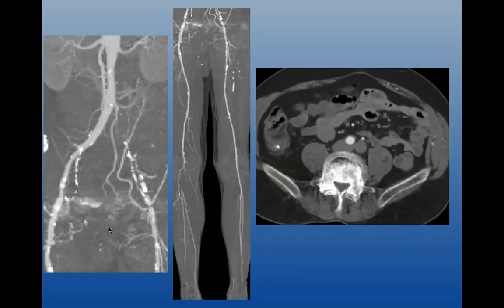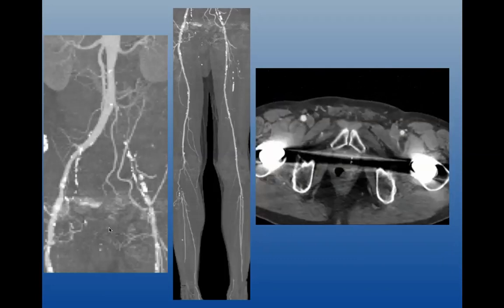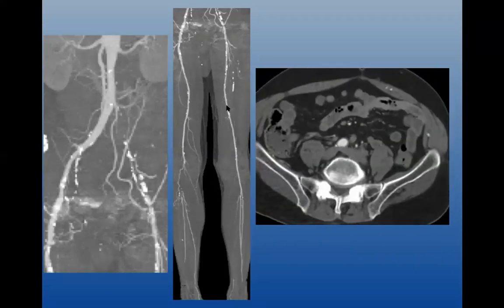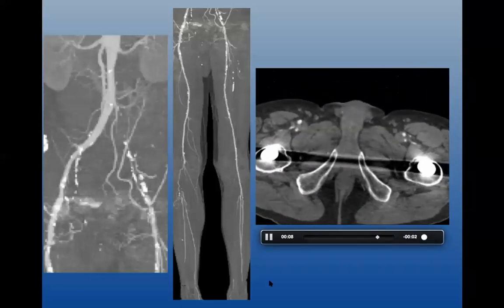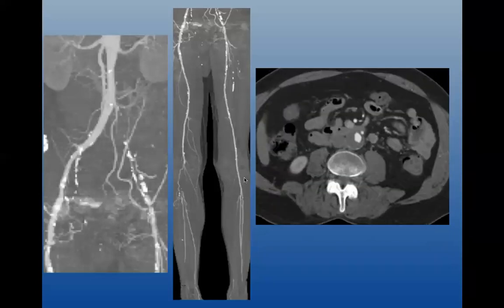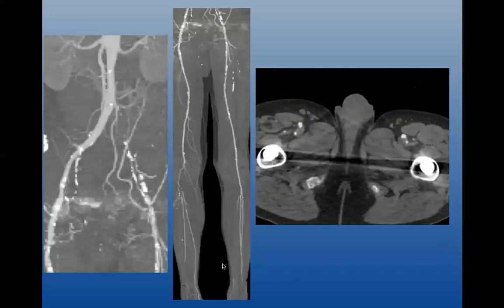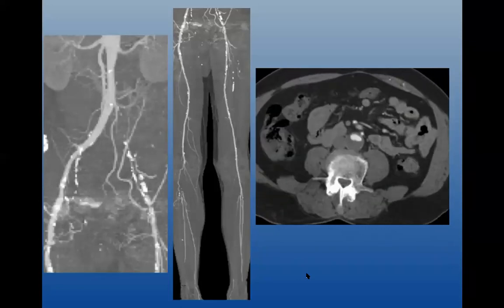This is actually a pretty complicated iliac case, if you ask me, because there's also disease in the distal aorta. And like most chronic total occlusions, when you have long segments, especially with inflow disease, you can see the rest of the leg looks pretty decent. Obviously he's got some tibial disease, but overall, look at that SFA and pop wide open on the left side. And that's the side where he's claudicating at 50 feet. That's worse than the right leg. Right leg, he's got a pop occlusion, but there's no need to address it at this point because right now he's saying the left side is what's bothering him the most.